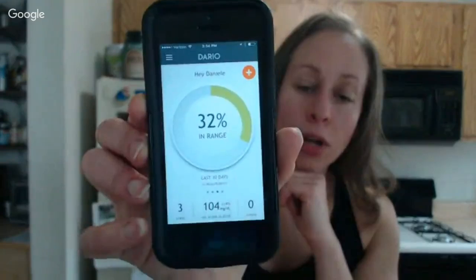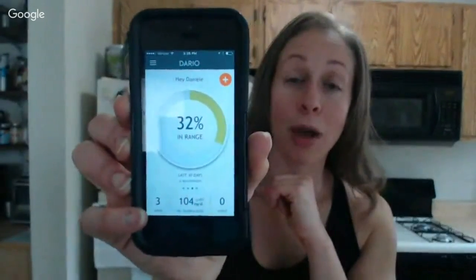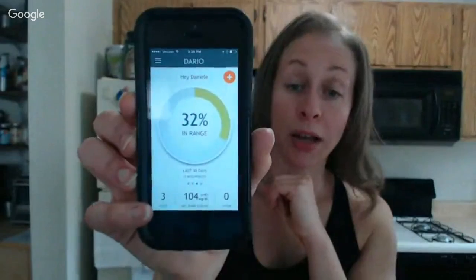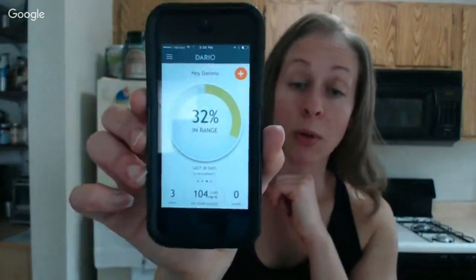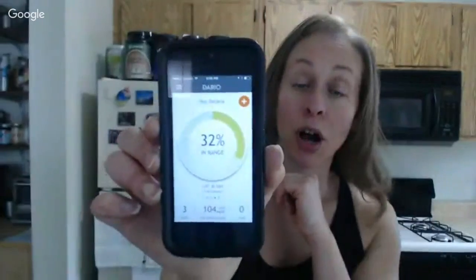So this is showing you on the main screen that in the last 30 days I've had 3 hypos. You can set your own, and I have my hypoglycemic set at 59. My average blood glucose reading has been 104, and I have 0 hypers. When I set this up, I set my hyper at 200, but on my Dexcom I set my hyper line at 130. I'm sure it was higher than 130 at some point, so it's not necessarily true, but that's completely customizable.